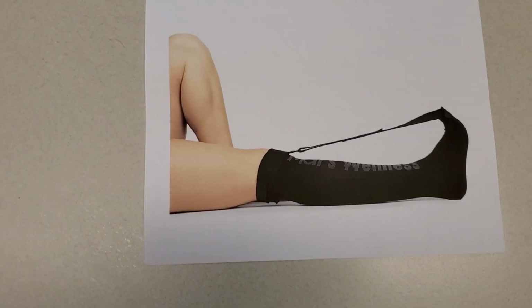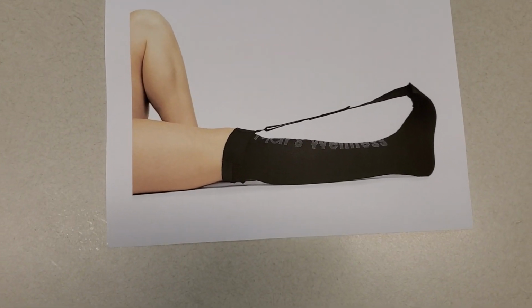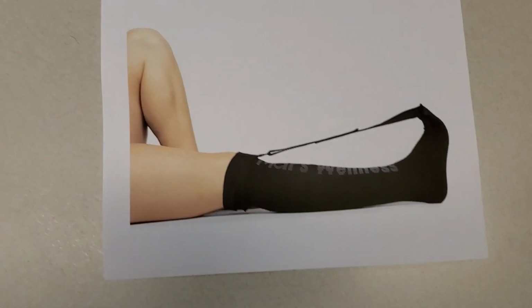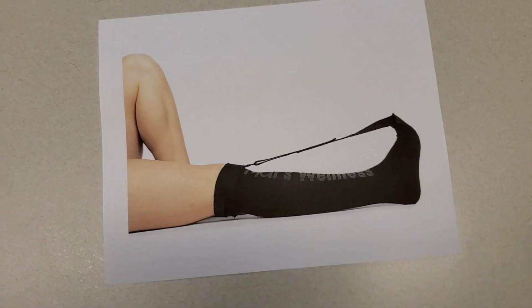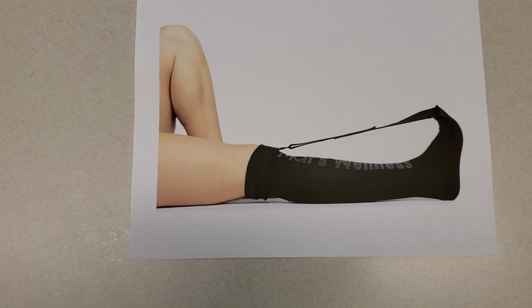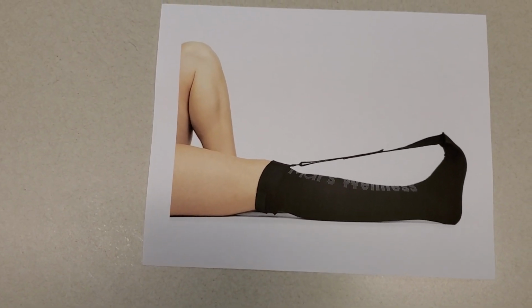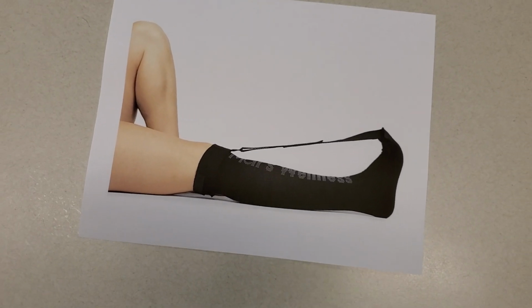Now, this is designed to keep your foot pulled up, as you can tell, because one of the hallmark symptoms of plantar fasciitis, which is really diagnostic, is when you get up in the morning, the first few steps are really painful. That's because the plantar fascia has a tendency to contract and get stiff overnight. And then when you stand up and put your body weight on it, it doesn't like that, and you have all the pain.